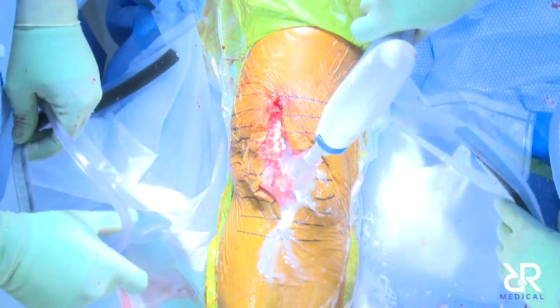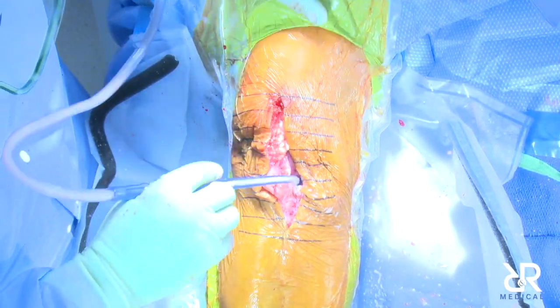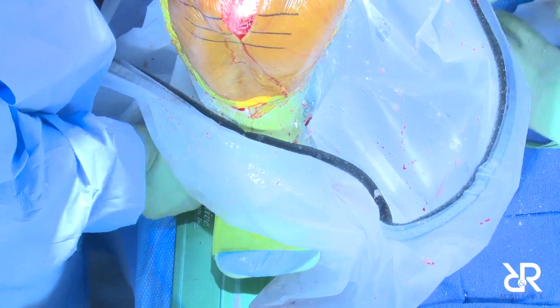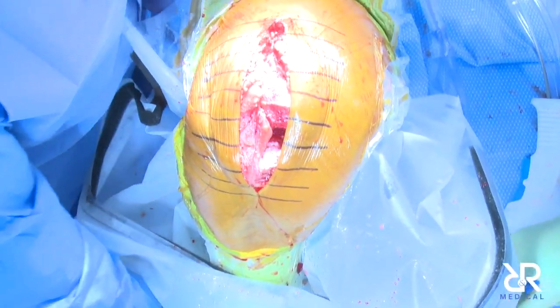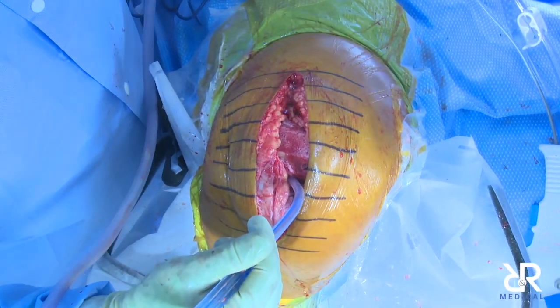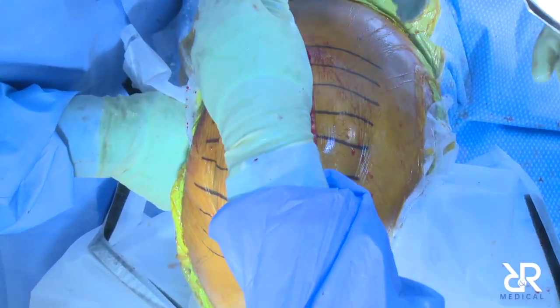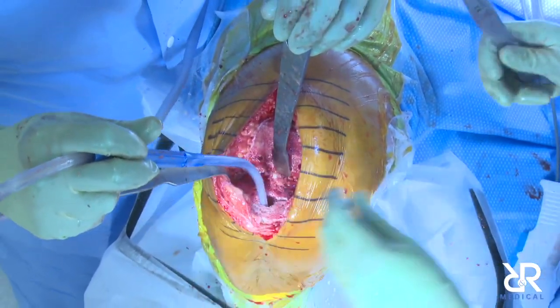Oh yeah, I mean that's the future, right? You just gotta have a good cut path and figure out what the interference fit needs to be, because it can't wiggle. And so, you know, put a press fit anterior, posterior. I think the United implant will be very good for it because it has a box cut. I talked to Dr. Kissen, and he's done some DJO, and he showed me some pictures, and that works really well as well. But you definitely have to have the cut path done correctly and figure out where the press fit needs to be.